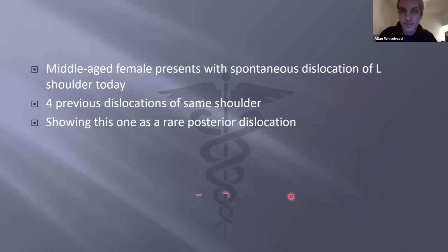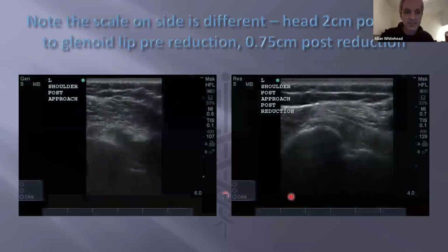Why is it not advancing? Here we go. So it's just a bit sluggish.